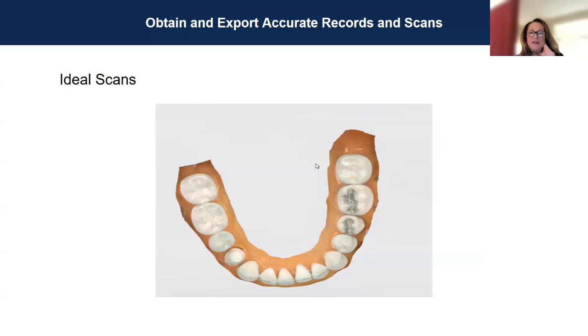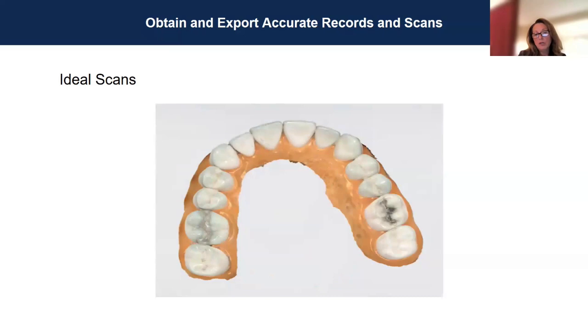Okay, this is not quite an ideal scan. Everything is, but if you see the little black, it's the reflection of this typodont. But on real teeth anatomy, if there was a black line that ran and it kind of looks a little bit scratched, that means there is not enough data. And then I would just go ahead and scan that area again, and that would fill in and make it all tooth colored. So here it shows that you have the distal of the upper terminal molars.